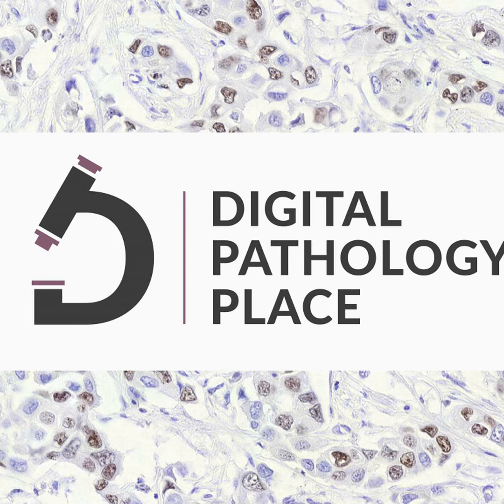So lossy DICOM conversion may affect AI performance. So may affect, right? It's not a disaster, but we have to pay attention, right? So this is a group from Germany, Frankfurt, Oldenburg, mostly Germany. The paper is in Scientific Reports.